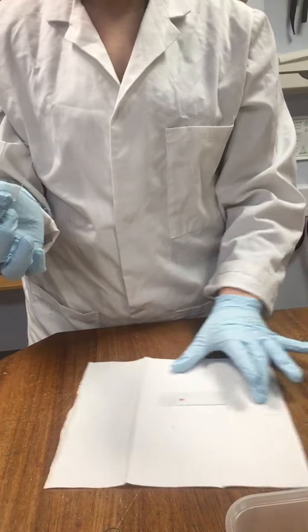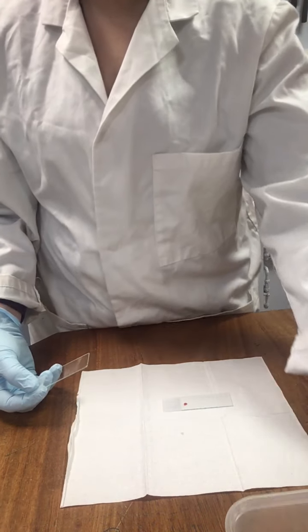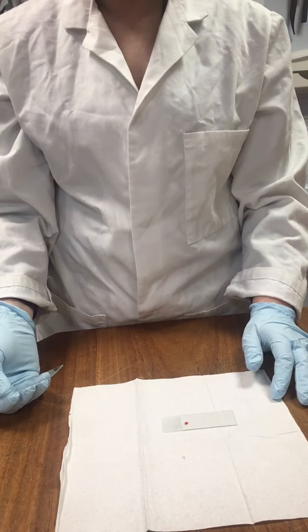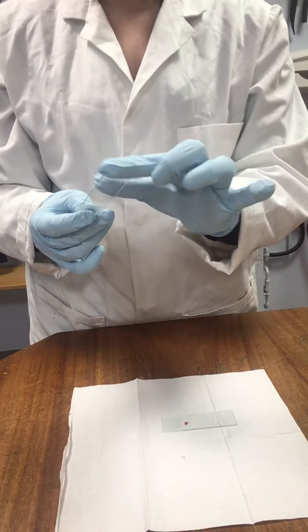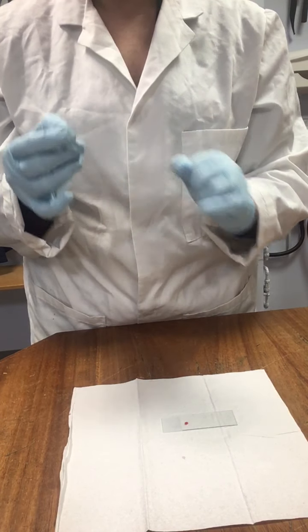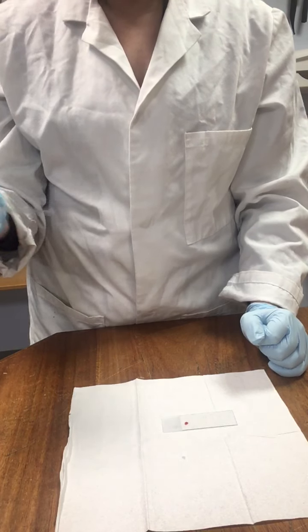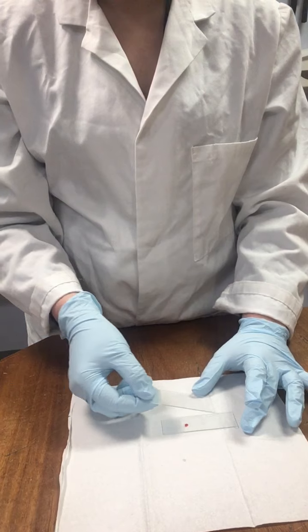So in terms of blood smear technique, there are a variety of different approaches you can take. Do have a look on Ledge, because there are a number of different videos up there for you to see. But basically what we want to do is, using the edge of the slide, we want to create a straight edge which our blood is going to migrate across, and that's what's going to give us the shape of our blood smear. So you can either push the spreader or you can drag it. It's entirely up to you.